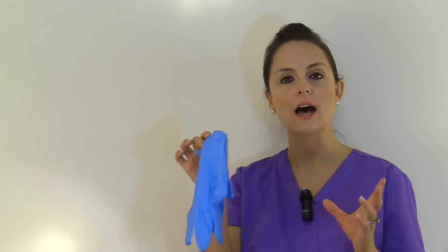And finally, gloves. Gloves will help protect your hands from any types of fluids or contaminants that you don't want to get onto your hands. Whenever you select your gloves, you'll want to select the right size based on your hand size.